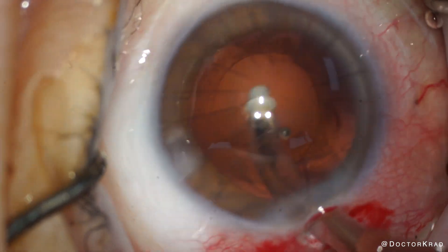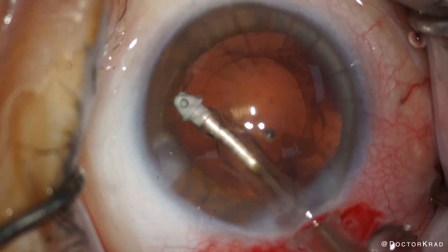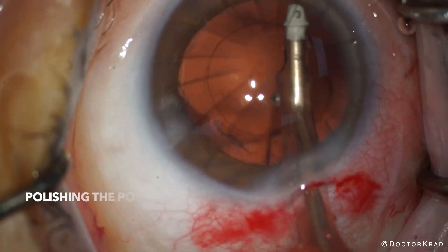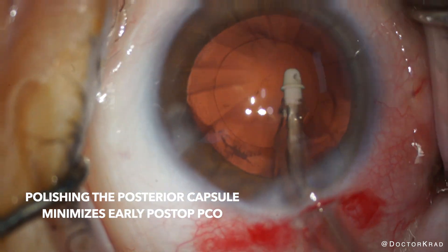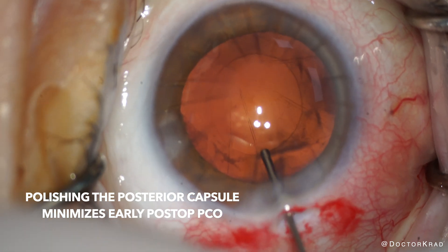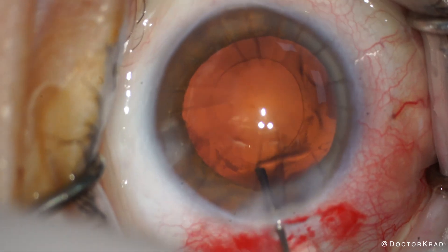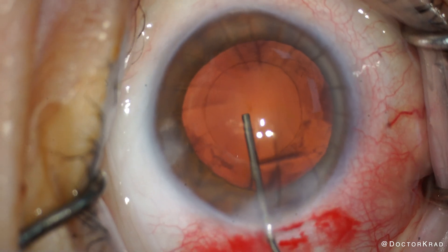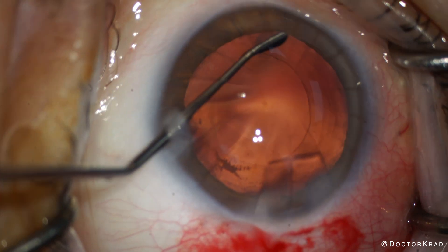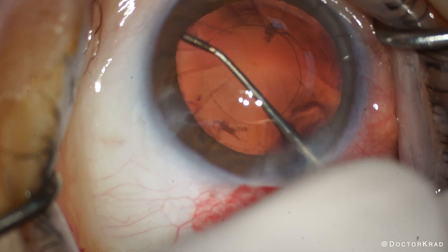Now that the cataract is out, I'm polishing the posterior and anterior capsule with both the IATIP, and then I'll do it with the sweep polisher. I also like to flush the posterior capsule — especially the central posterior capsule — with BSS. This will minimize the risk of early post-operative PCO and we'll get a fair assessment if a patient likes their lens implant. Next, we're expanding the capsular bag with cohesive viscoelastic, then polishing the anterior capsule with the Singer-Swift polisher. And then I'm going to expand my incision to 2.75.